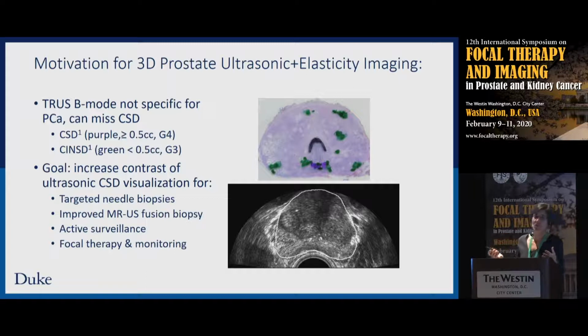So our motivation, of course, is to provide better visualization of prostate cancer in ultrasound imaging. And if we can do that consistently, and particularly if we can be sensitive to clinically significant disease, this would improve ultrasound-targeted biopsies. It would also have the potential to improve MR fusion biopsies. It would have applications for everything we've been talking about today if we could just do a better job of visualizing the prostate cancer in ultrasound.